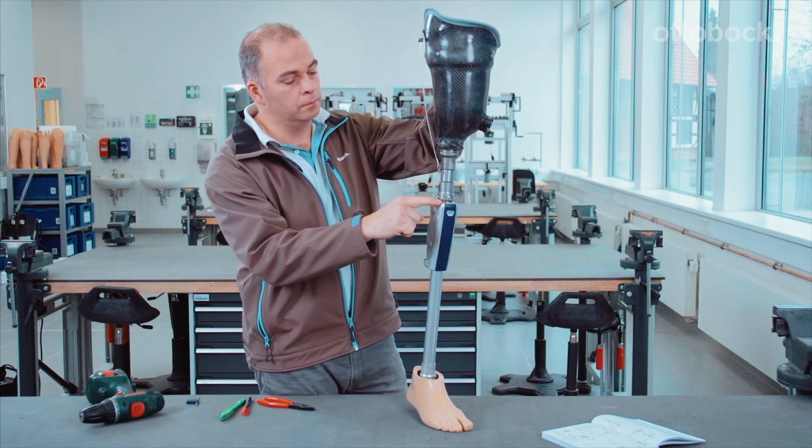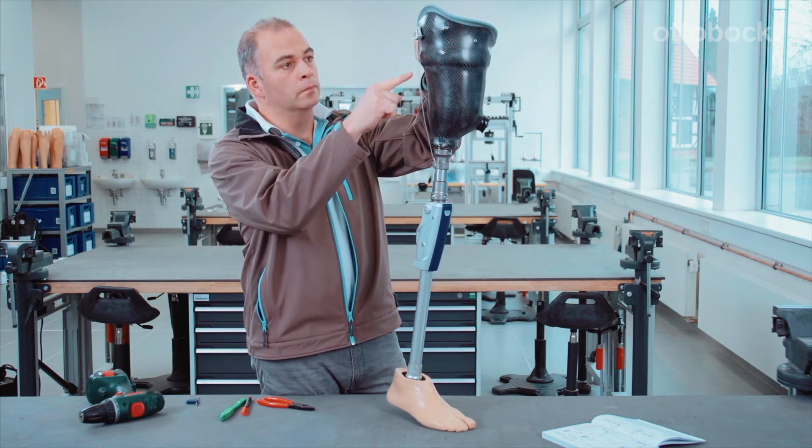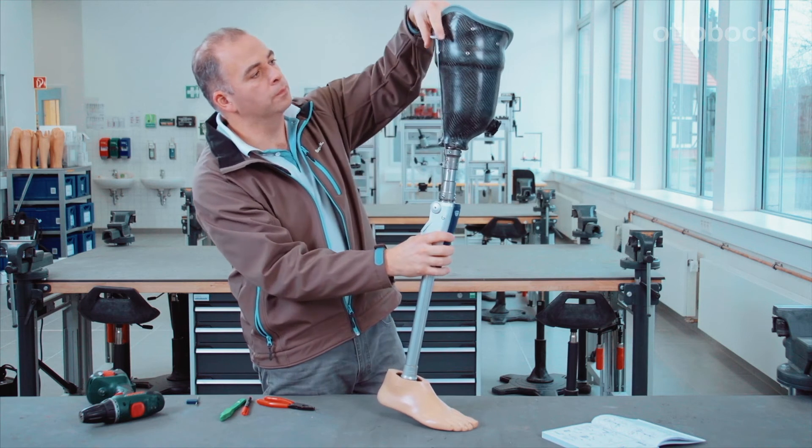Finally, check that the lock release cable is correctly installed and that the locking function of the knee joint disengages reliably.